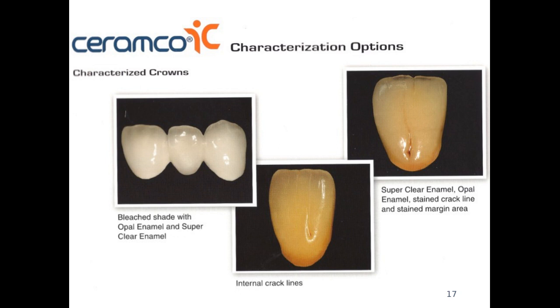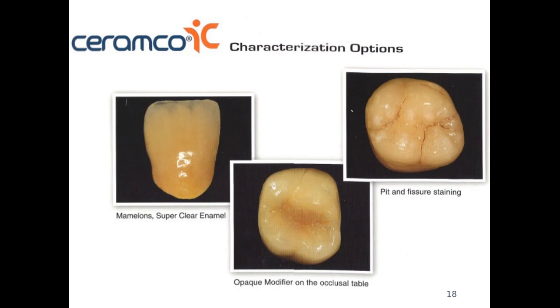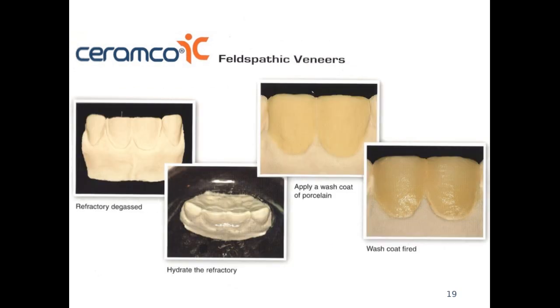Crack lines are used for older patients who may have those features — they are added towards the end after building up the incisal using stains for those characterizations. The same applies to the occlusal surfaces of posterior teeth to indicate pit and fissures, and on the occlusal table where some patients may have a slightly darker shade; we can use stains to copy what the patient has.